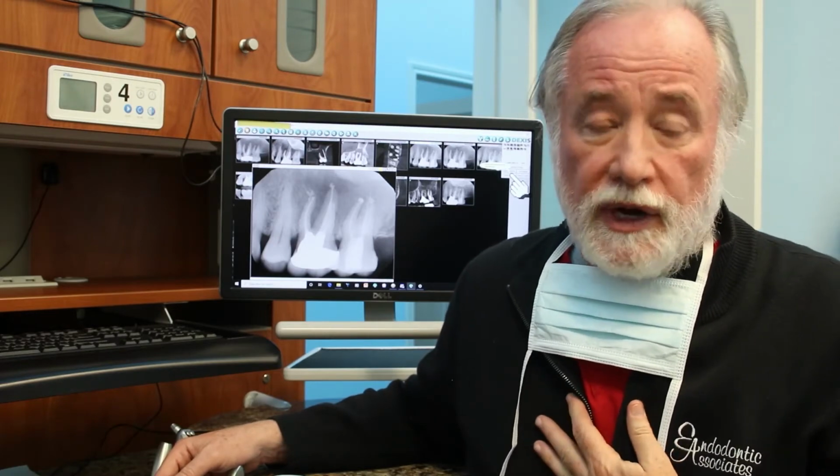Obviously, I've been doing root canals for a long, long time. And we've been using this GentleWave process now for 5 years, and we're seeing phenomenal results with it. And this is one of those cases that is an absolutely phenomenal result by using the GentleWave.